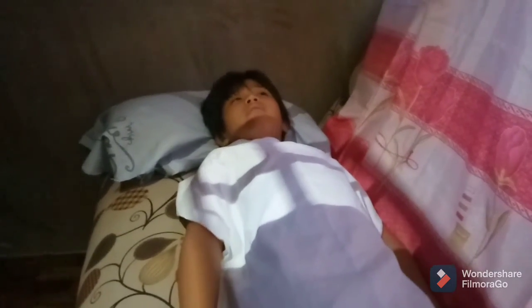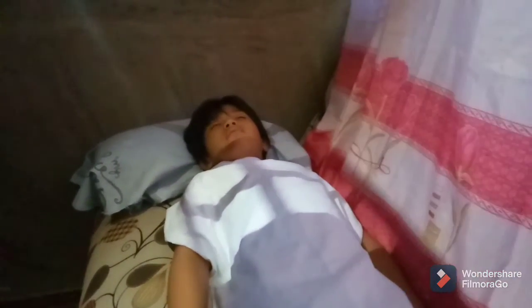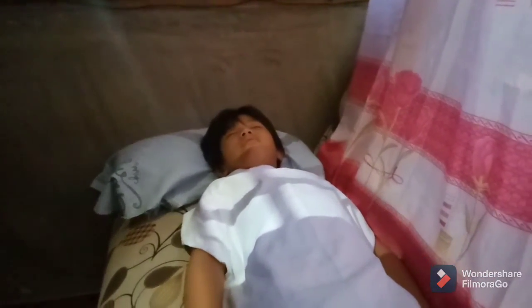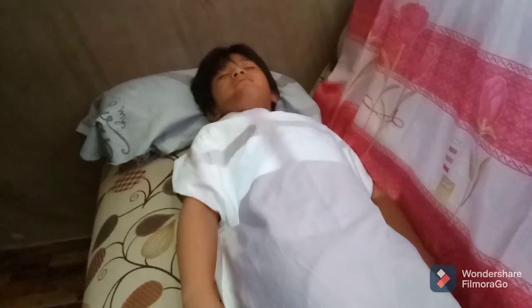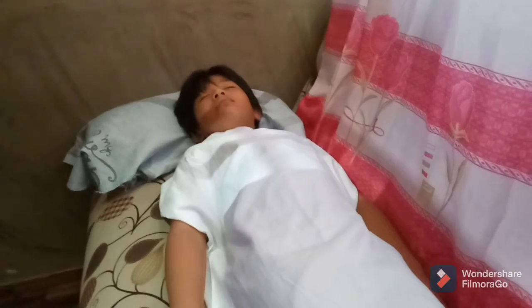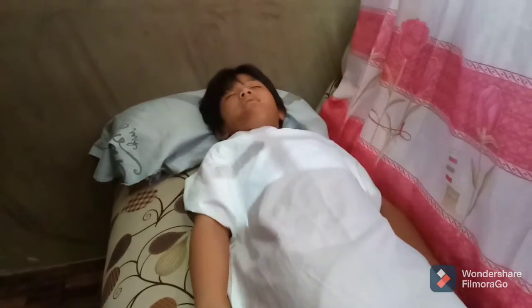In patient positioning, position the patient in a supine or erect position. In today's video, we're going to use the supine position. For part positioning, align the midsagittal plane to the central ray and midline of the table and IR, and adjust the head so that a line from the lower margin of the upper incisors to the base of the skull or the mastoid tips is perpendicular to the table, and for the IR, a line from the tip of the mandible to the base of the skull should be parallel to the angle of the CR. Ensure that there is no rotation in the patient's head.